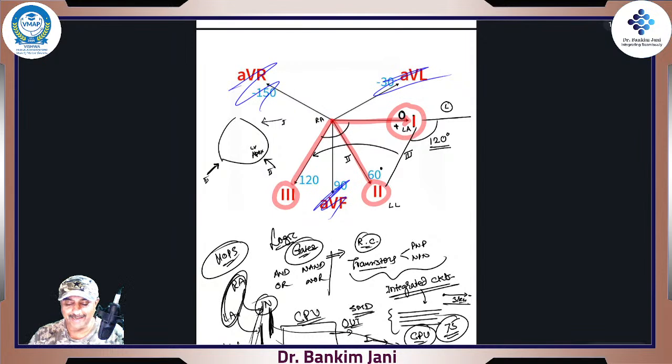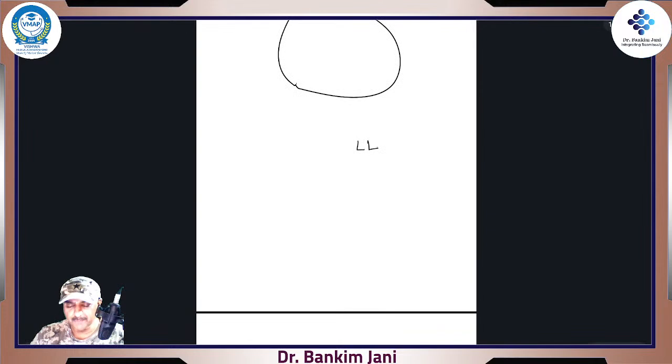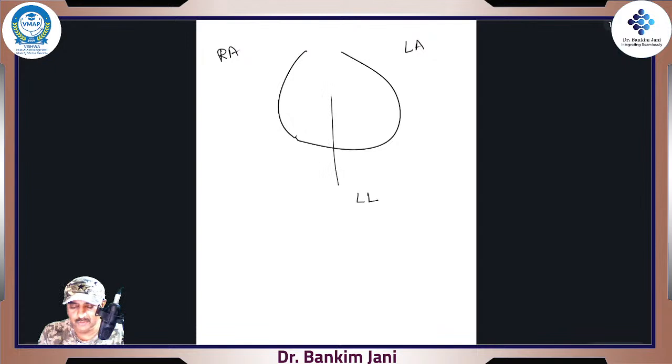AVF, right? A, we understood that it is the augmented. So we have increased the value, right? So this is the VF. VF means, simply speaking, it is watching from below. Absolutely down. So this is VF. Augmented, that's why we are telling AVF. Right?